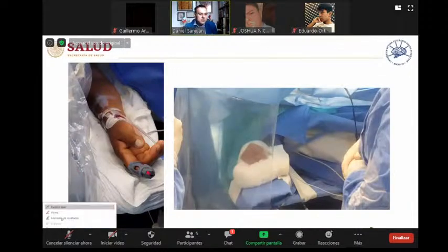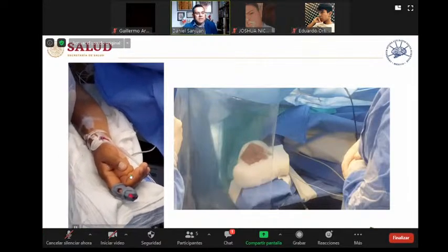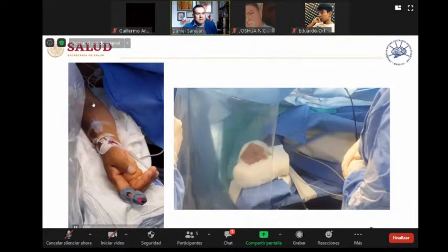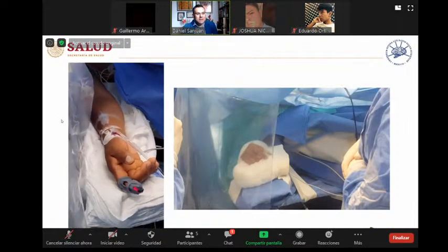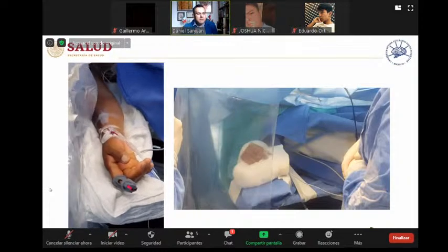So now I'm going to show some videos about the different combinations possible using electrodes, or in this case, that we are not using electrodes or needles on the hand. But we apply the stimulus electrically on the opposite side under general anesthesia. The patient is not aware.